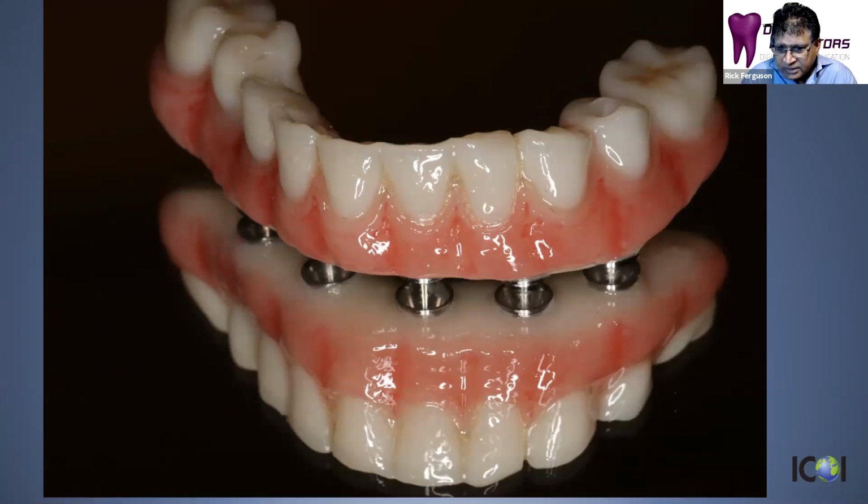Now, our assistants are trained to do this. This is actually something we teach in our, when we get back to doing live courses, we'll be teaching, although we teach this in our online course as well. The idea is that this is something that the assistants can do ahead of time, and it's fairly easy to do. The Nexcom product actually comes with a nice manual, which was written by Christian Coachman on how to achieve good aesthetics with these products. And you can see here, this is a temporary hybrid that my assistant characterized for us. Most of the time what we're doing is characterizing it mostly ahead of time.